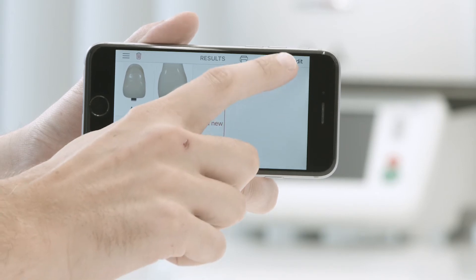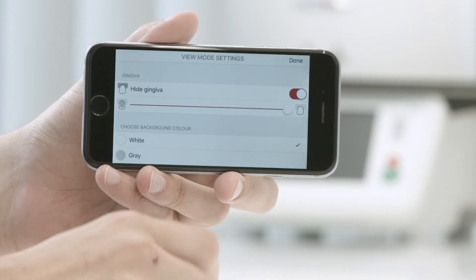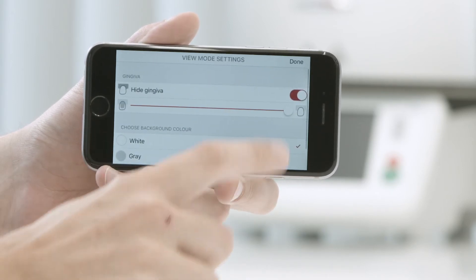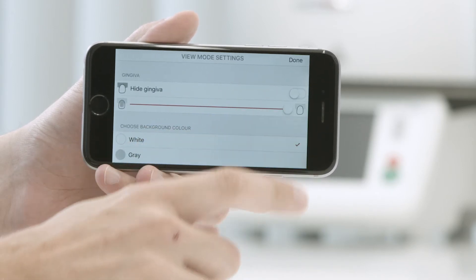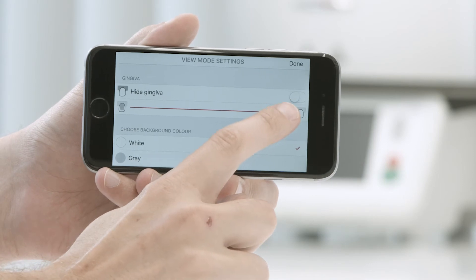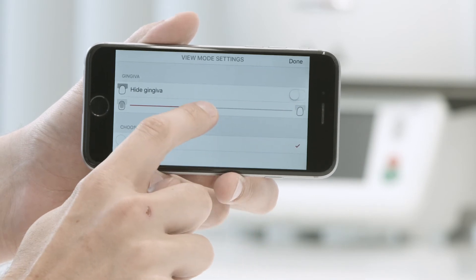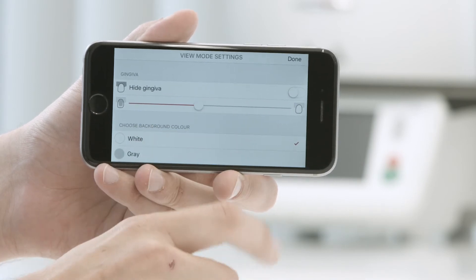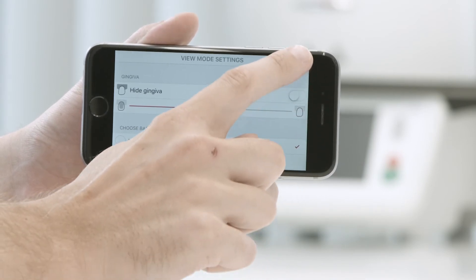To change the transparency of the tooth, move the slider to the desired position. In this way, you can assess the shade and geometry of the tooth stump.